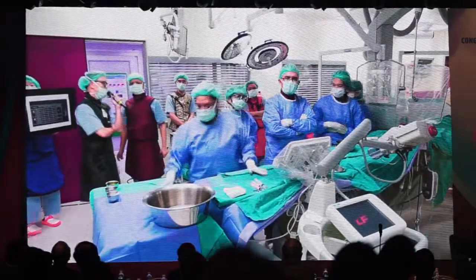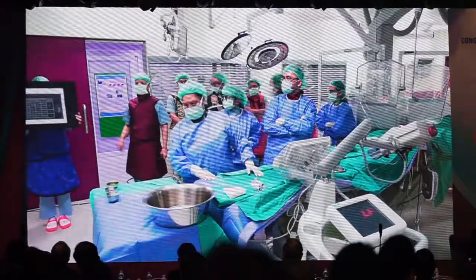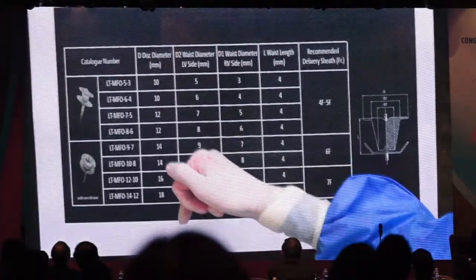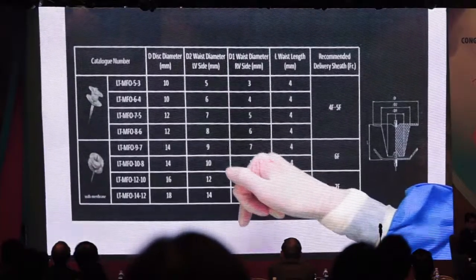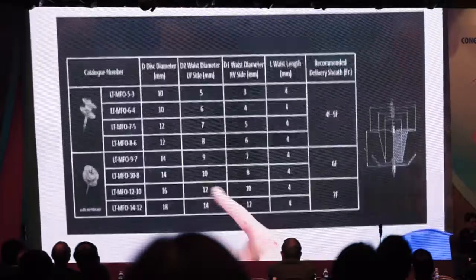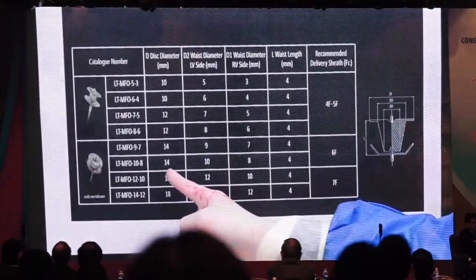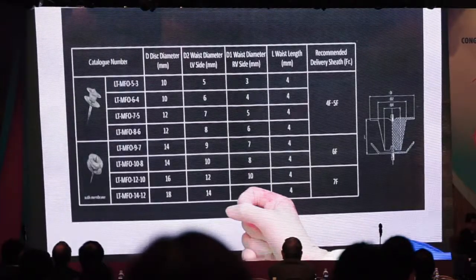Apart from that, inlet extension definitely carries a risk of heart block, but I saw the ECG showing a plus 60 degree axis, so it's not really worrisome. If it is definitely minus or zero, then I will have a serious look at that. So the ECG is looking reasonably okay. This is only an inlet extension. There is a reasonably good peripheral septum. We'll be careful to position it in the transition. Okay, let's carry on with the 7 millimeter.